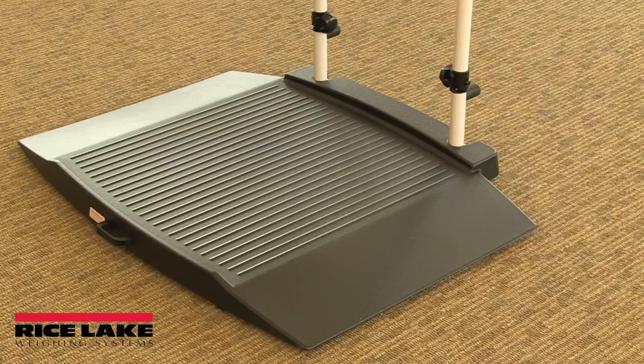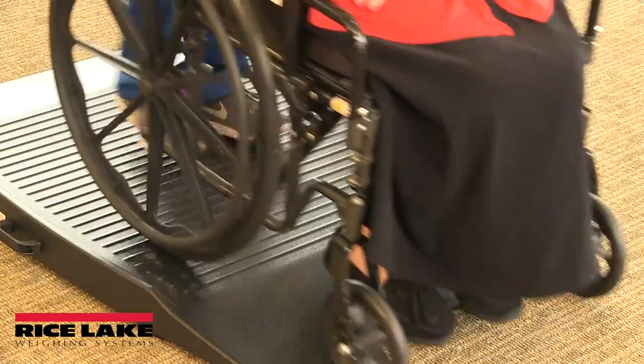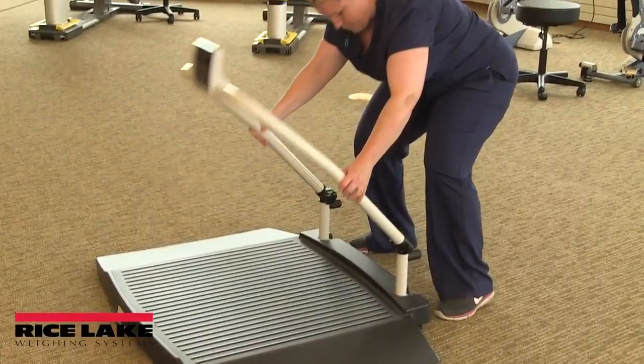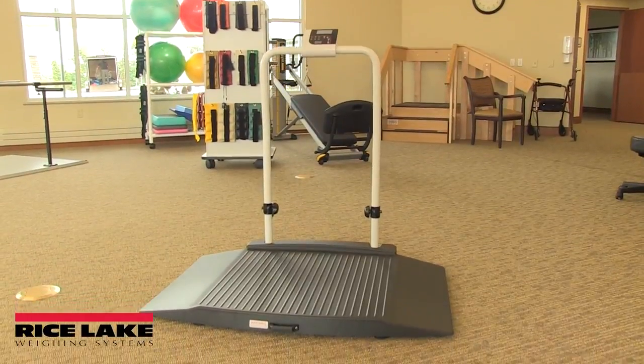Make sure the scale is placed on a flat, level surface and access to the ramp is unobstructed. It should be oriented so the patient's wheelchair can easily utilize the ramp when rolling onto and off of the scale. Do not place the scale on thick carpeting. The scale should not be placed beneath heating or cooling vents or areas with environmental vibration.